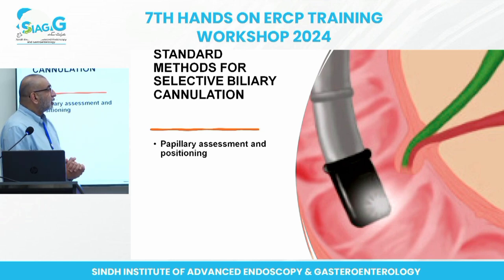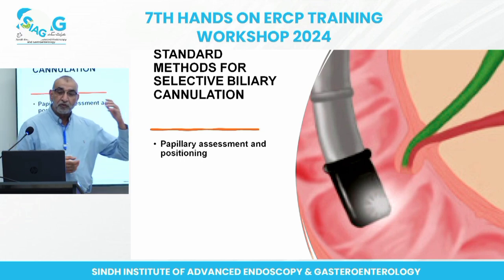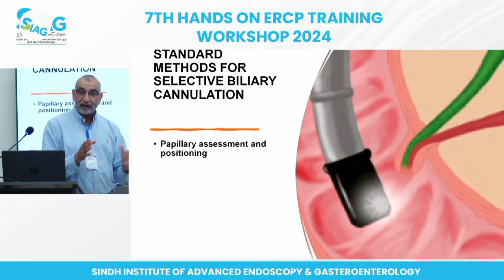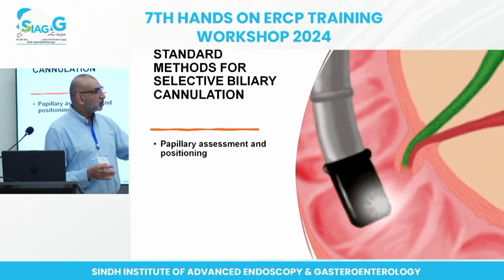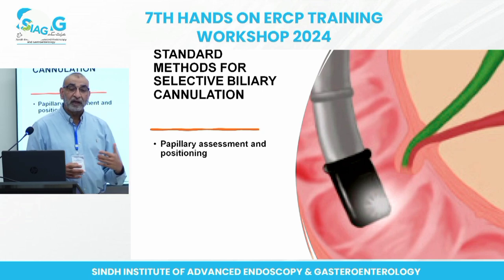Again, standard method for selective biliary cannulation, papillary assessment and positioning, that is the most important step in your procedure. The rest is, once you get that under your belt, slight adjustments here and there. So the most important thing is positioning. And positioning can be difficult at times.